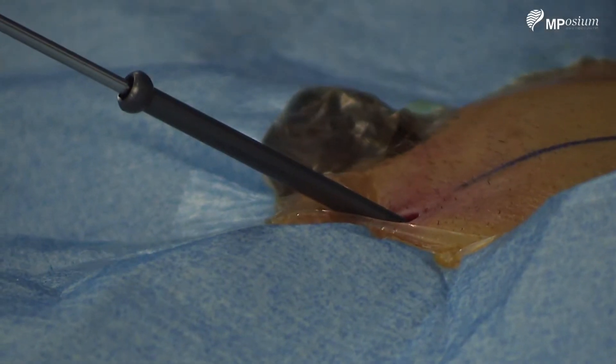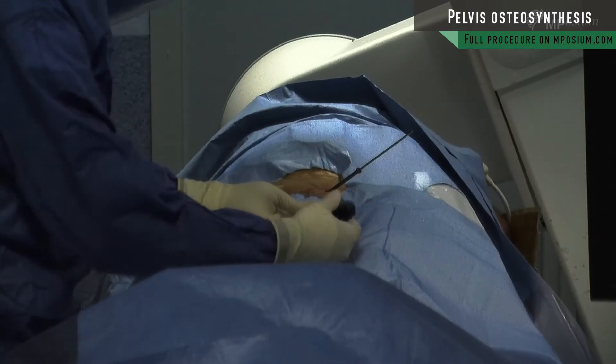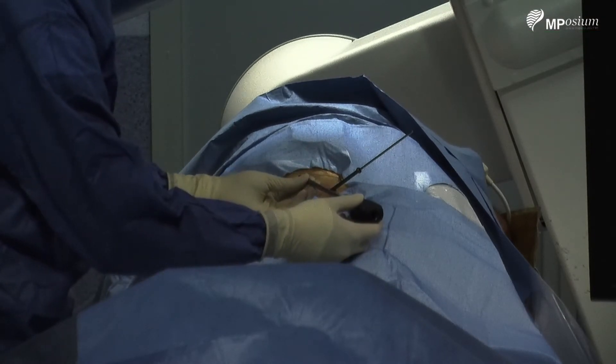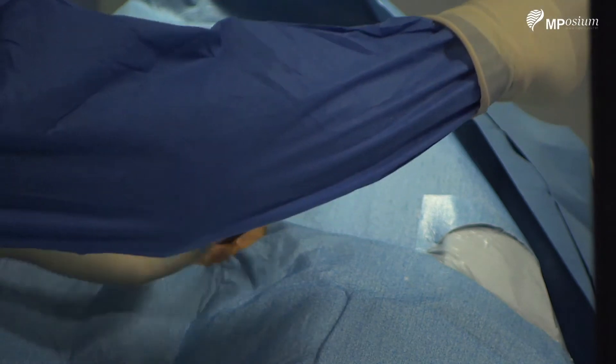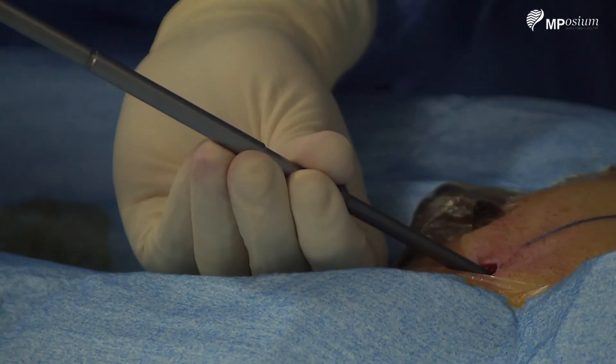Now I will use the cannulated screwdriver to advance the screw. The cannulated screw is inserted over the guide pin, and I will screw the bone.